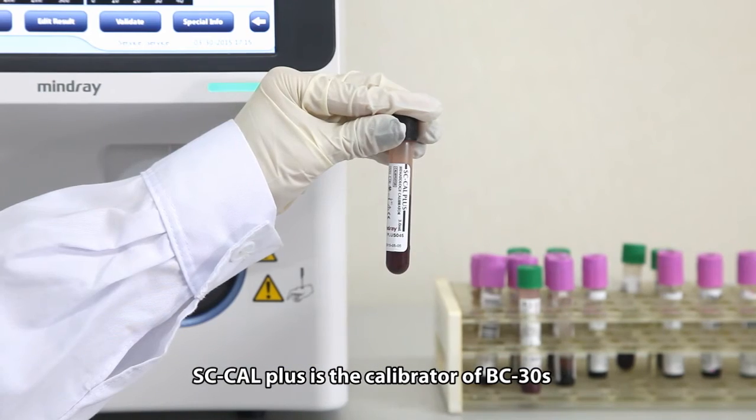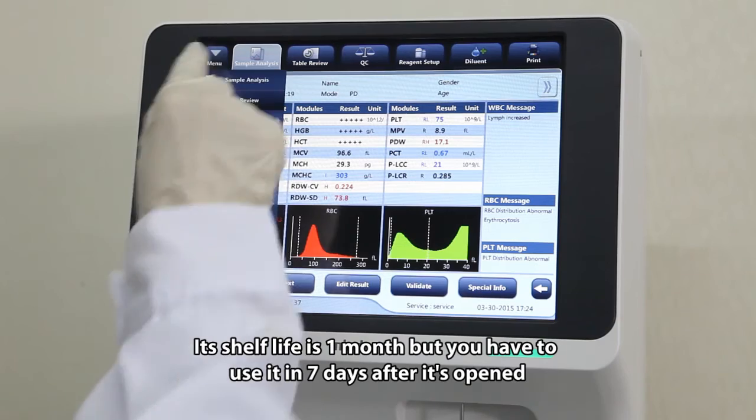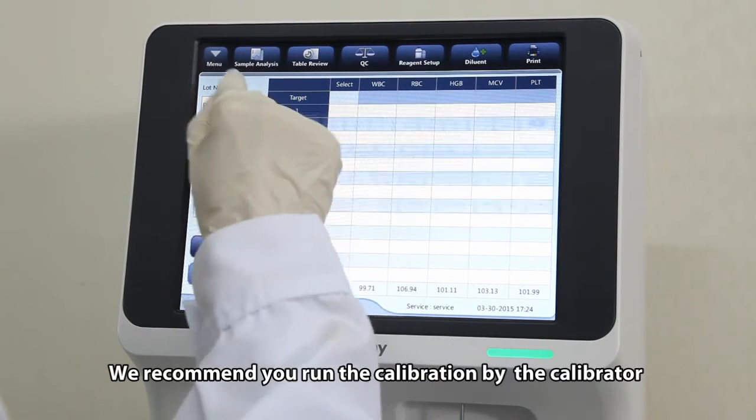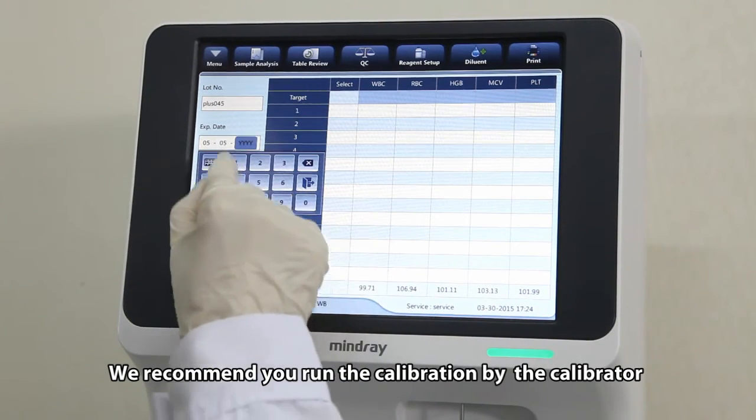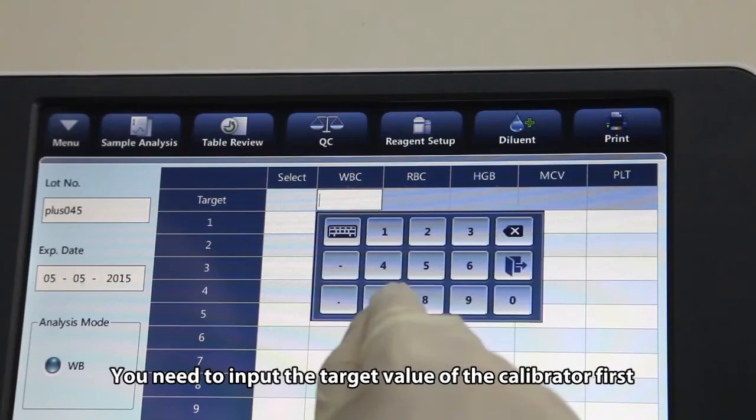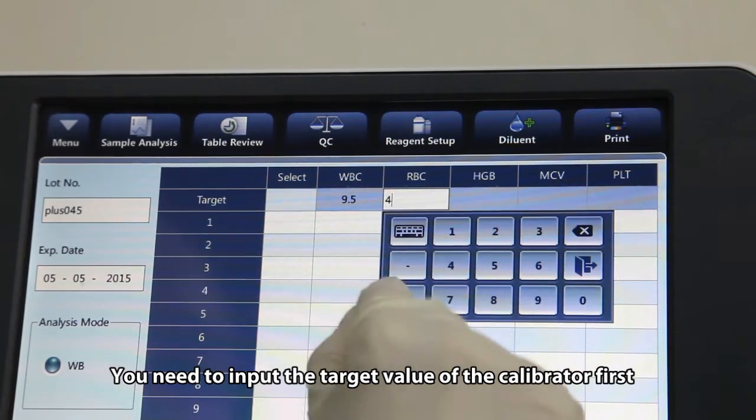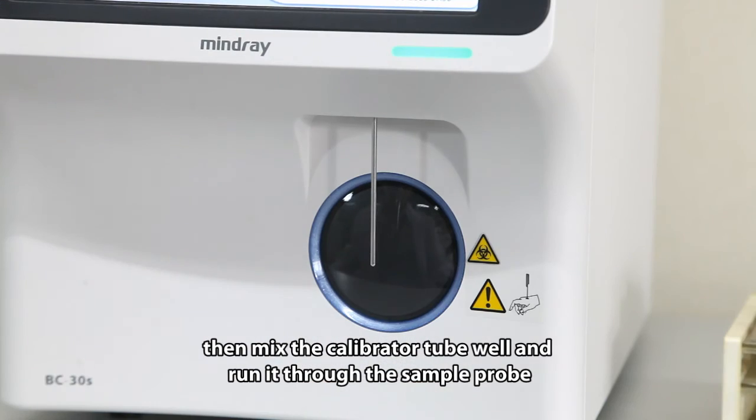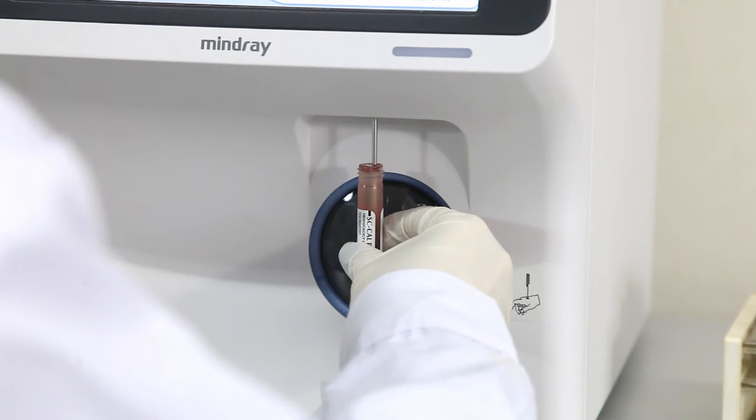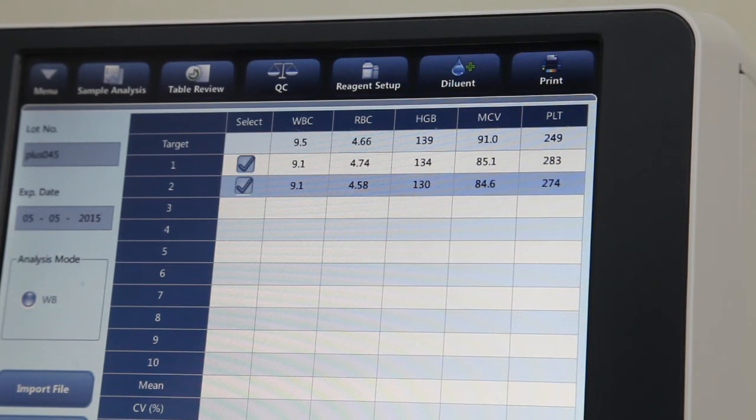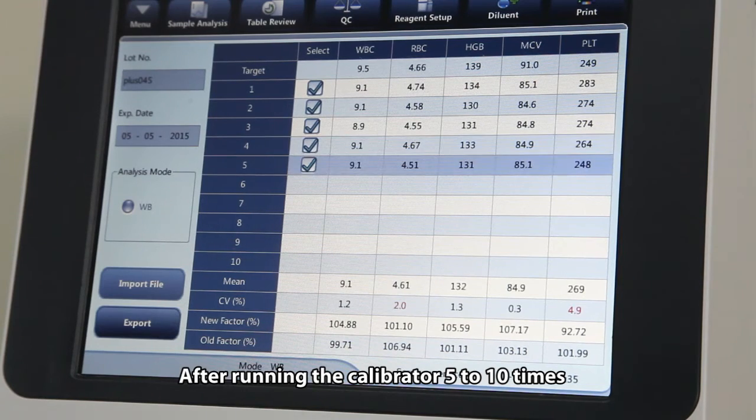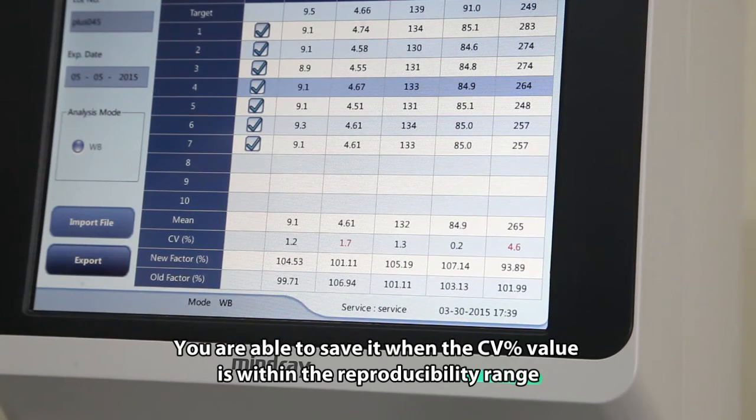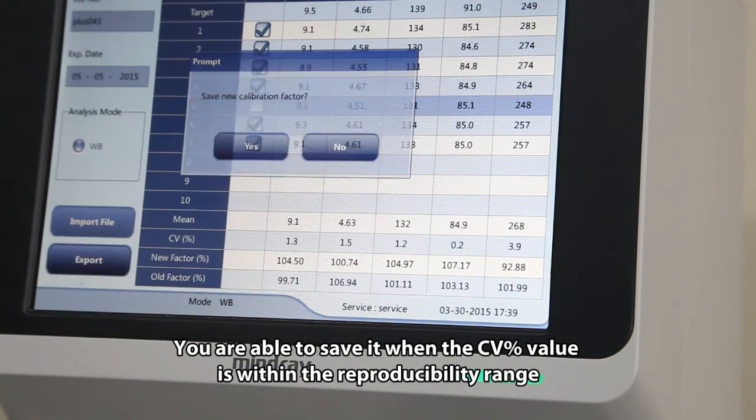SC-Cal Plus is the calibrator of BC-30S. Its shelf life is one month, but you have to use it in seven days after it's opened. We recommend you run the calibration by the calibrator. You need to input the target value of the calibrator first. Then mix the calibrator tube well and run it through the sample probe. After running the calibrator five to ten times, you may get the new calibration factor. You are able to save it when the CV percent value is within the reproducibility range.